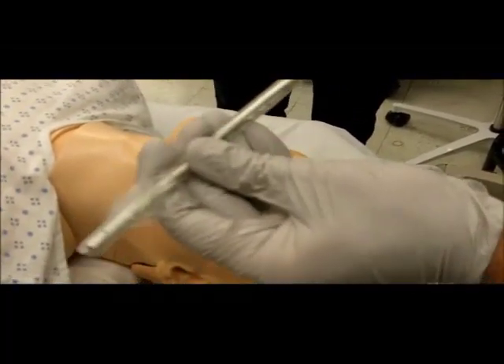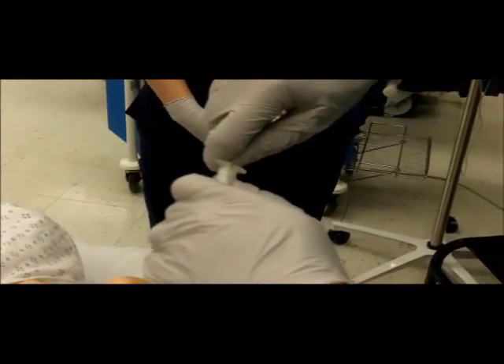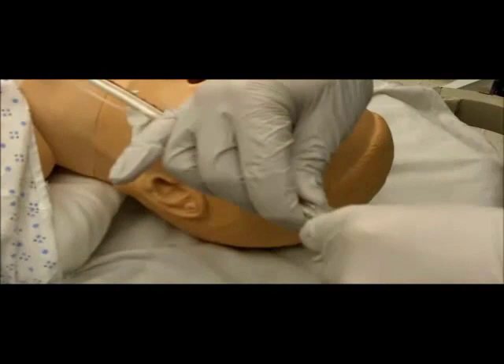When the stylet is in the correct position, engage the locking piece into the endotracheal tube connector and secure. Bend the tube and stylet just proximal to the cuff at a right angle.